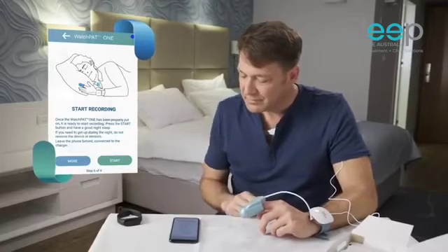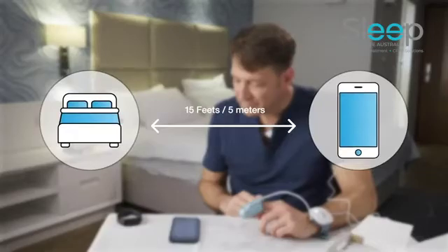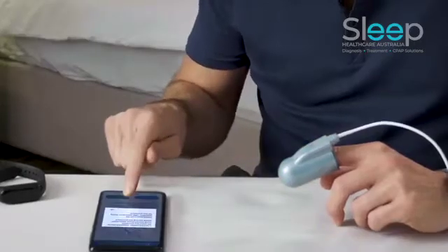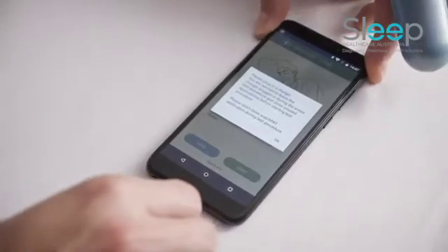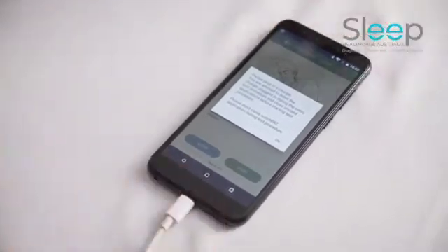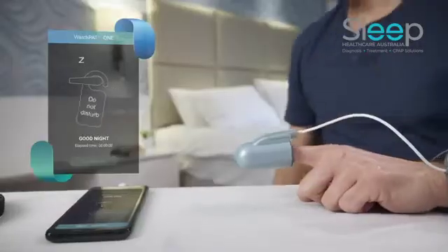Now you are all set. Make sure the phone is placed no more than 15 feet (5 meters) from the bed. Press start recording to start the test, and keep the phone plugged into the electricity socket all night. The phone must remain plugged into the electricity socket, otherwise the test will not proceed.